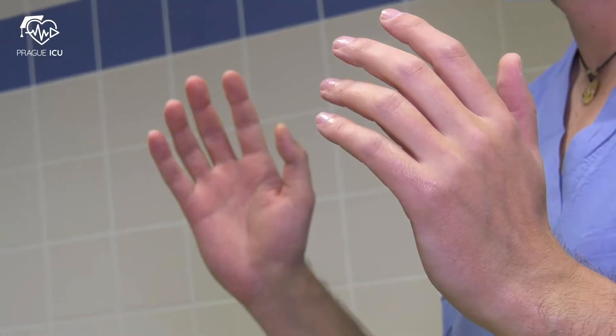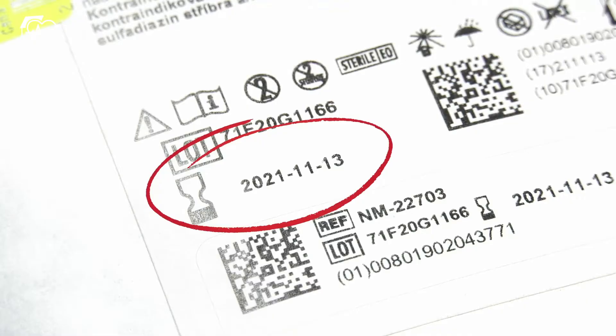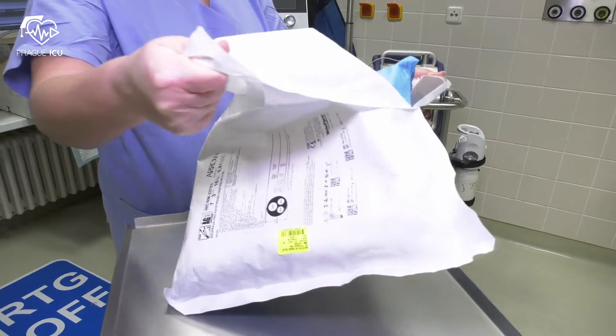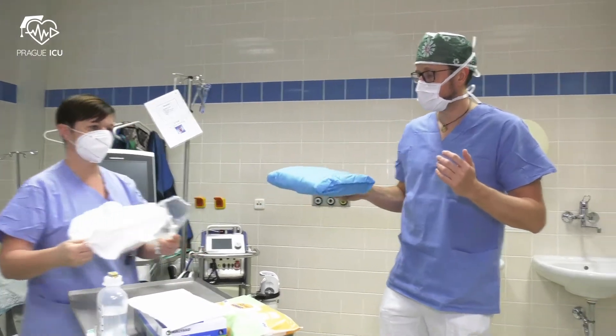Then proceed with gowning and setting up the sterile trolley. First of all, check the expiry date of the package. Take the sterile CVC pack and carefully unfold it.